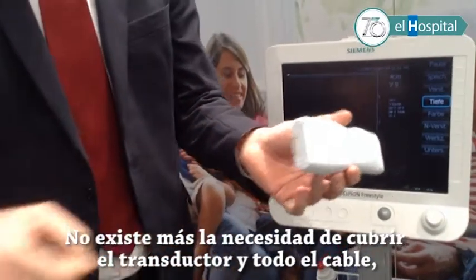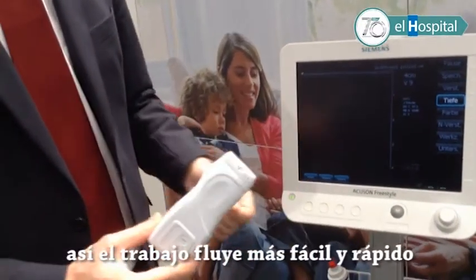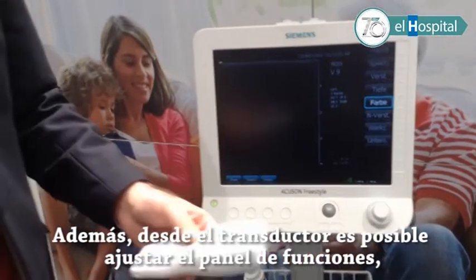There is no need anymore to cover the transducer and the whole cable, so the workflow is much faster and easier. Even the operation of the probe is possible here on the device itself, so the user stays sterile.